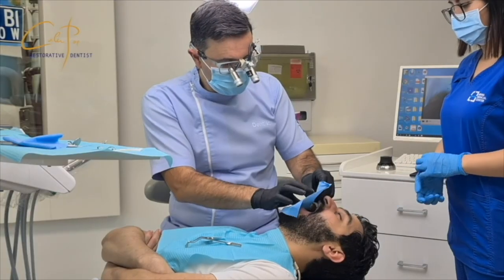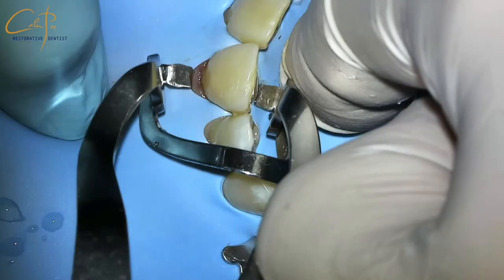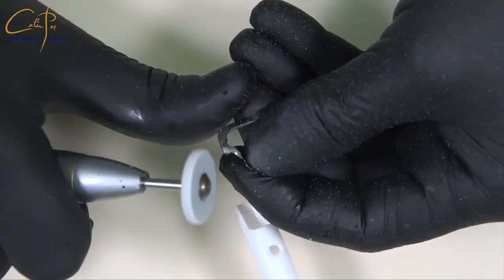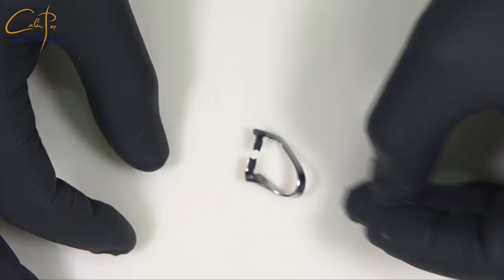Marking, punching, and placing the rubber sheet on the teeth through the perforated holes. For the two central incisors I am using cut B5 clamps from the Brinker set. I stopped using B4 clamps to isolate anteriors because they have fragile stability; the B5 cut clamp is much more stable and provides more space due to its longer arch.